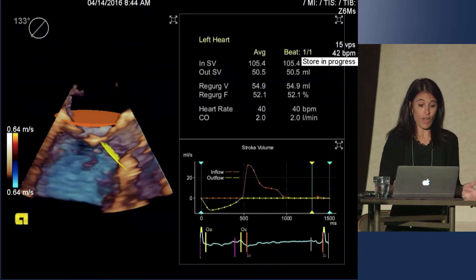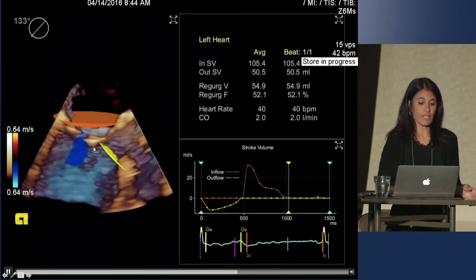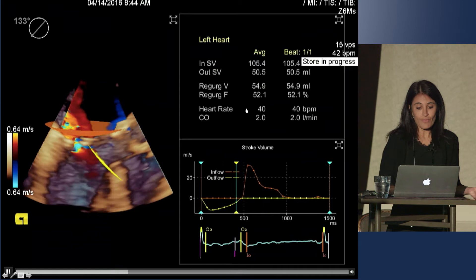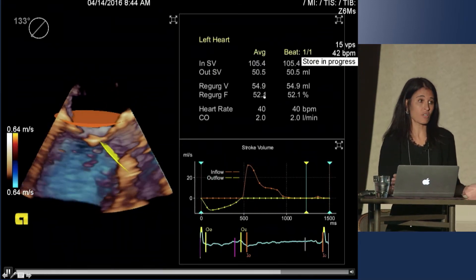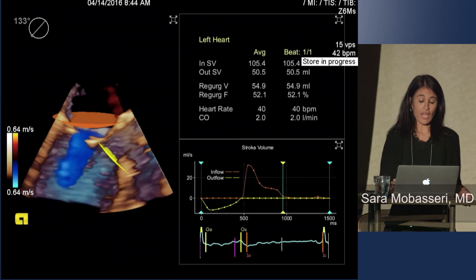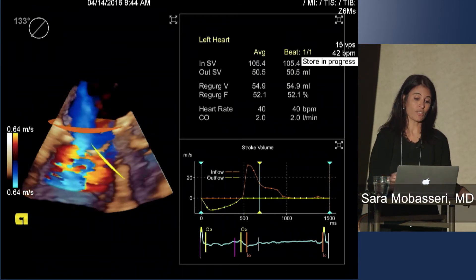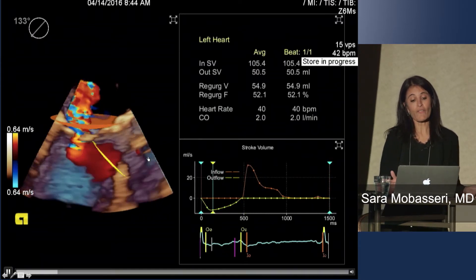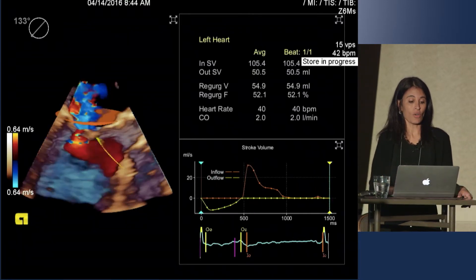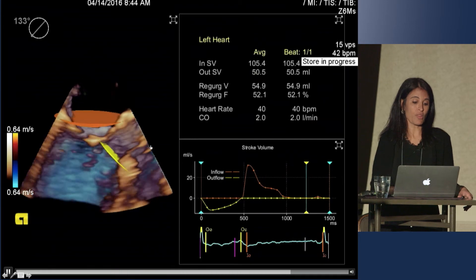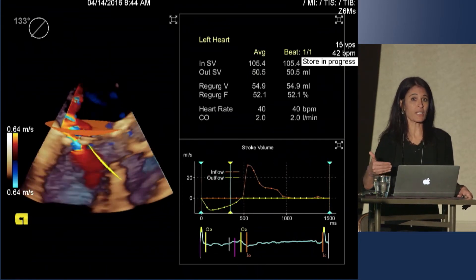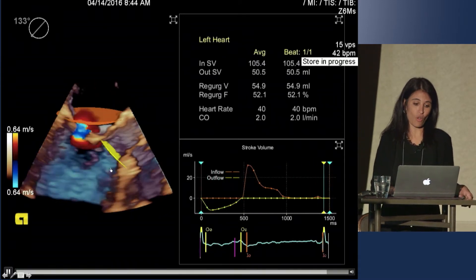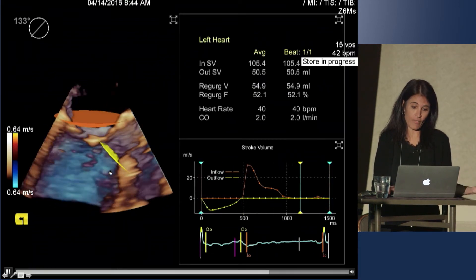We currently have offline a way to look at regurgitant inflow and LV outflow so we can calculate regurgitant volume. Here these are just discs in place to look at the mitral valve inflow and LV outflow, and that way we have some numbers to look at. It looks like we have a regurgitant volume of close to 55. Sometimes there's a question: if the patient has aortic insufficiency, does that affect the calculation? Mild or even moderate doesn't really affect it, and even with severe AI you have to remember that we're looking at relative change in the same patient from baseline to post-clip, so the degree of AI is not going to change.